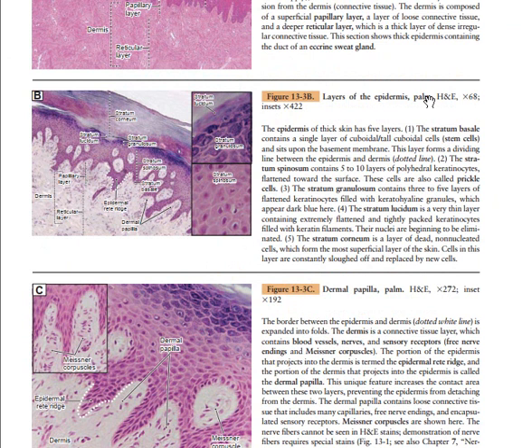Now these are the layers of the skin, seen with the hematoxylin and eosin stain. You have the stratum corneum. Here, as you can see, the stratum granulosum. You need to know that the stratum granulosum contains 3 to 5 layers of flattened keratinocytes filled with keratohyaline granules, and those keratohyaline granules are the ones that make it look dark on the hematoxylin and eosin stain. At the level of stratum corneum, you have keratin.